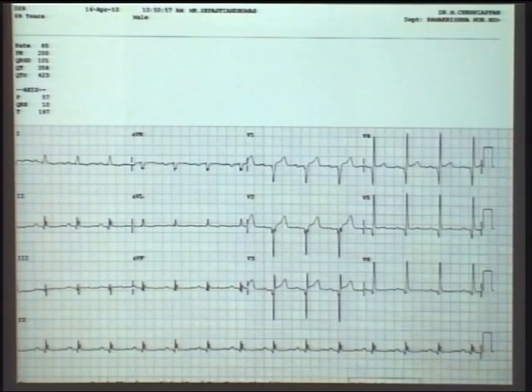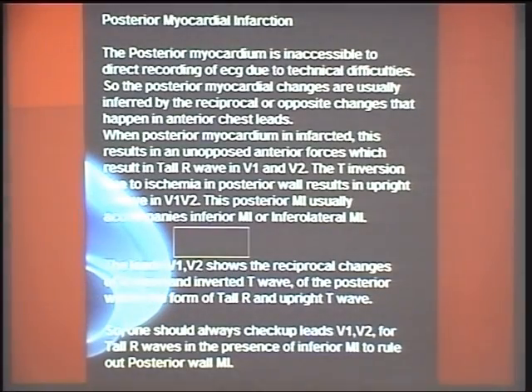Whereas in an infarct like this, what do I infer? Only a small area I have infarct, the majority of the area is still healthy. So this fellow will have a good prognosis. Whereas a fellow who has got V1 to V6 with no R wave, everything is Q wave, this fellow will have a bad prognosis. So not only do you diagnose infarction, you diagnose how much of the myocardium is involved in the infarction process.